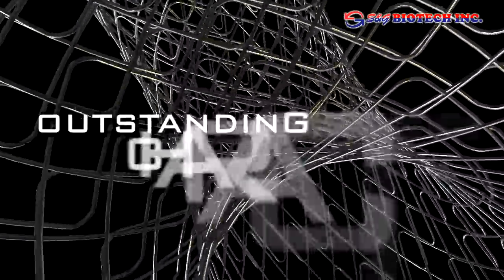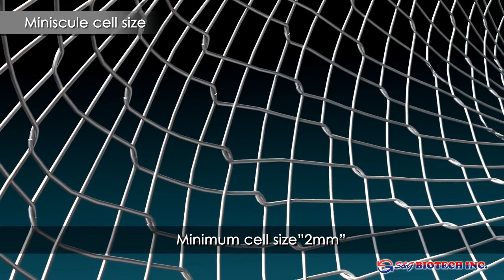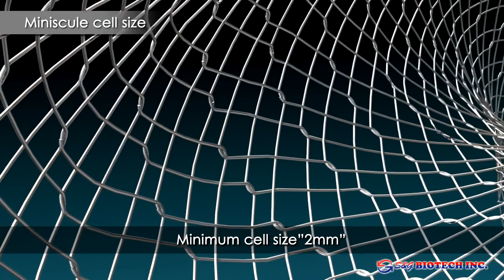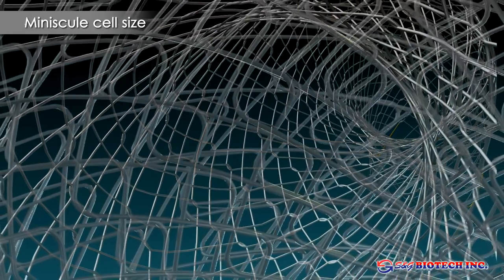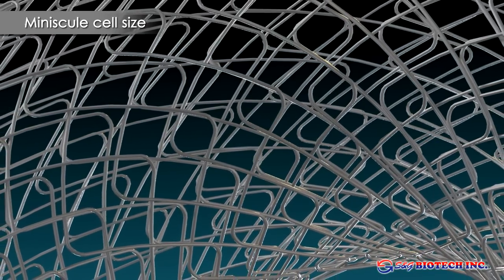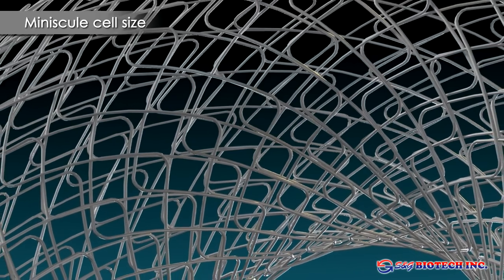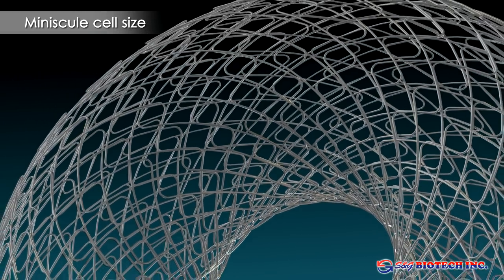Now let's look at the outstanding characteristics of these stents. The very small cell size in the double-layered structure reduces tumor ingrowth. In addition, the high cell density avoids jamming of adjacent segments of the stent, guaranteeing smooth coaxial alignment within the lumen of the gut or bile duct.